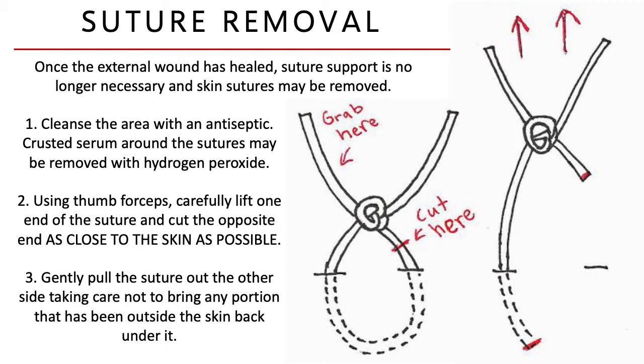Okay? Because if you cut it too far from the skin, yung part ng suture na nasa labas, na nadudumihan, na pwedeng merong bacteria na napunta doon, ipapasok mo siya through the skin and that could cause infection.